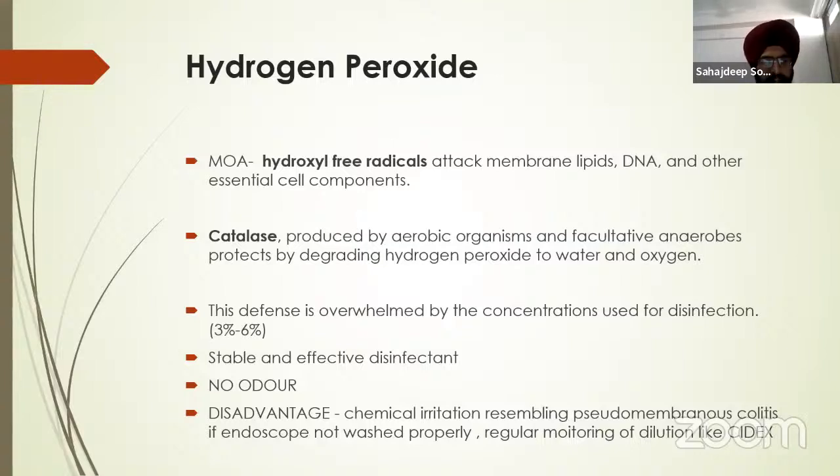Then they are stable and effective disinfectants, and it has no odor. The disadvantage is it is a chemical irritant, can cause pseudomembranous colitis. Regular monitoring of dilution is also required, like in Cidex or glutaraldehyde.